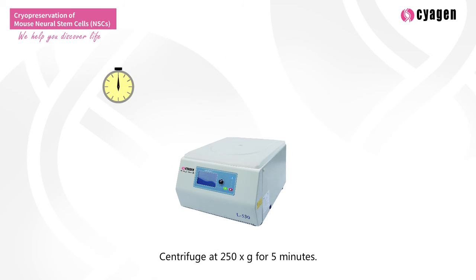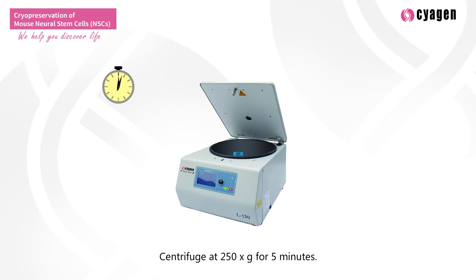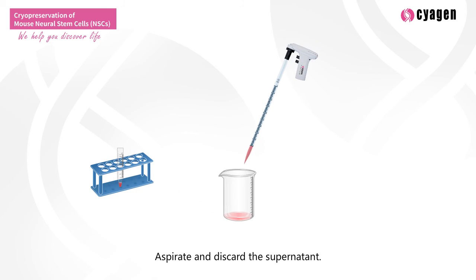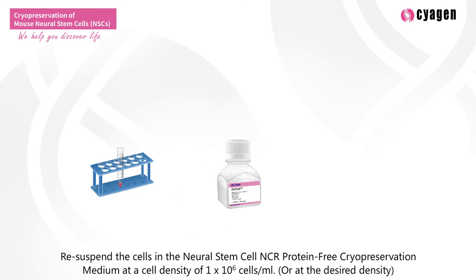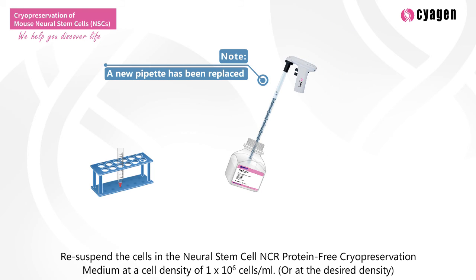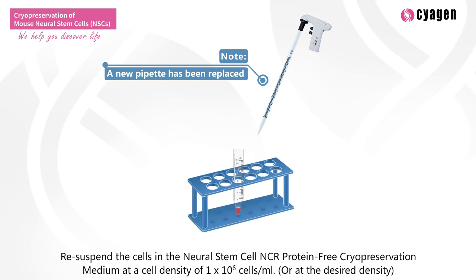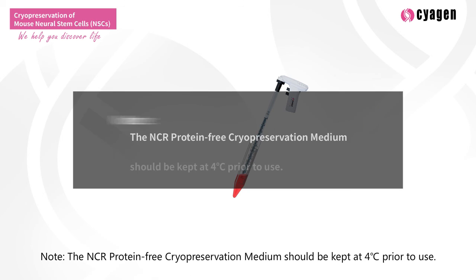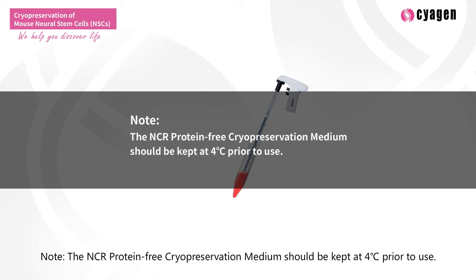Centrifuge at 250 times G for 5 minutes. Aspirate and discard the supernatant. Resuspend the cells in the neural stem cell NCR protein-free cryopreservation medium at a cell density of 1 × 10^6 cells per ml, or at the desired density. Note: the NCR protein-free cryopreservation medium should be kept at 4 degrees Celsius prior to use.